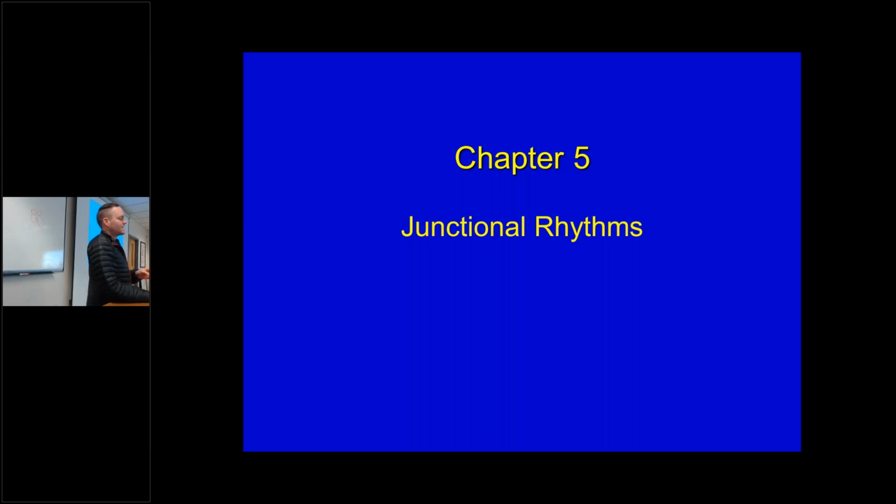For testing, at least for Monday, know the five criteria when you're looking at an EKG. What's the five criteria? As you're going through all of the EKGs and slides that we've been going through, we describe what?